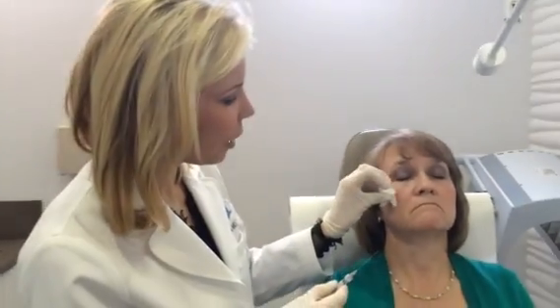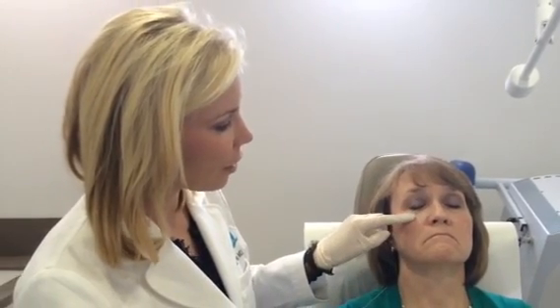So I converted over to mostly cannula use. I occasionally use a sharp needle when I'm doing under eye filling. About 2 to 3 years ago, when these Dermasculpt cannulas became available, I started using a longer one, a 2-inch one. And as you can see, I've made a little entry point with a numbing dot on the patient's cheek. With that, I'm going to be able to fill in this tear trough region.